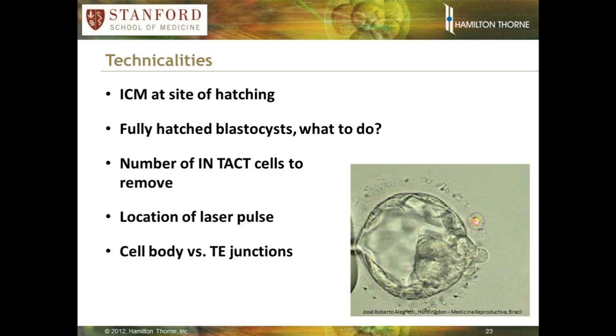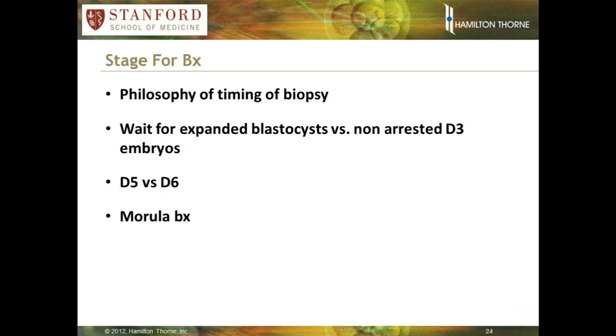So that's an important feature to pay attention to, which relates to the last two bullets on the slides, which are to really emphasize looking at where the cell junctions are and trying to apply the laser between the cells versus on the cells themselves. Occasionally, this cannot be avoided. Remember, we're dealing with a three-dimensional structure, and there may be cells beneath the cells we're firing on that may indeed get some laser on the body, but that is not a problem given the number of cells we have to work with. Next slide, please.